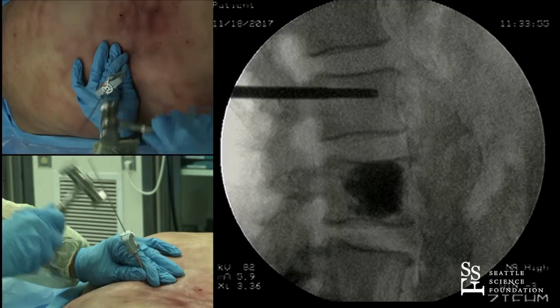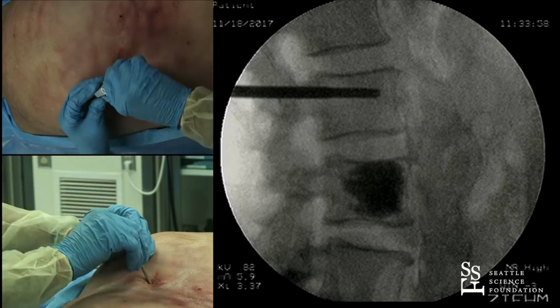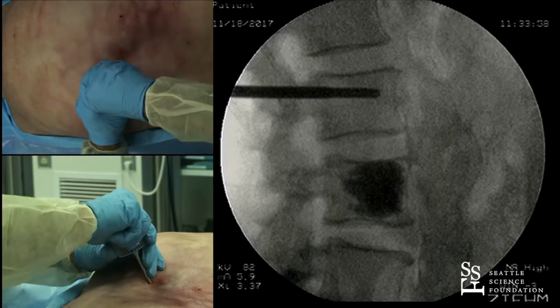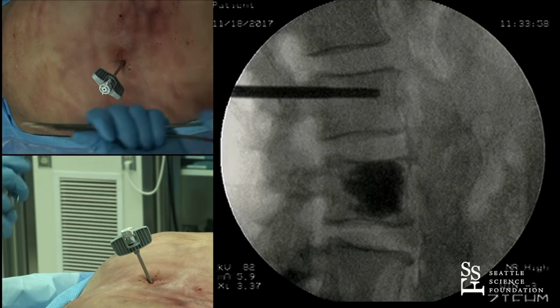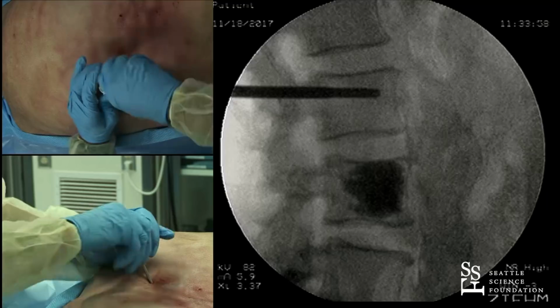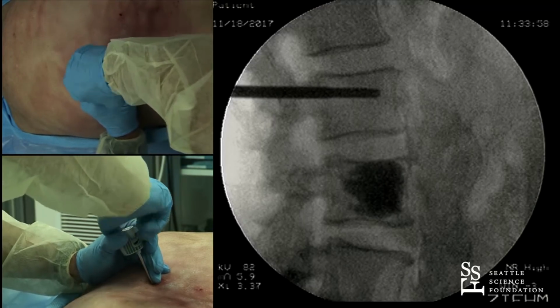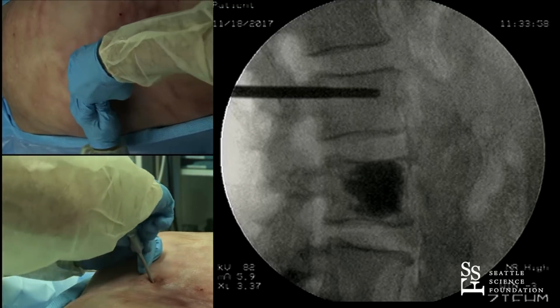Take the drilling dilator up to about within 5 millimeters of the anterior vertebral body. And this thing will come out the center, and what we'll see is we'll be left over with the outer cannula that's quite a bit shorter than the inner portion. And I'm going to extract that. That's got a little torque on it, so I'm going to use a clamp. I'm just going to work at it till it comes out. Sometimes these will, in hard bone or a frozen cadaver like we have here, be somewhat difficult to get apart.